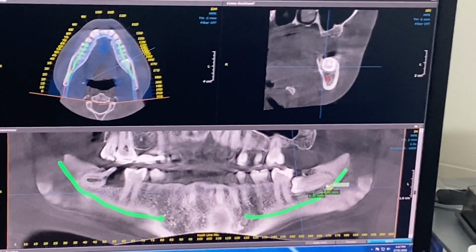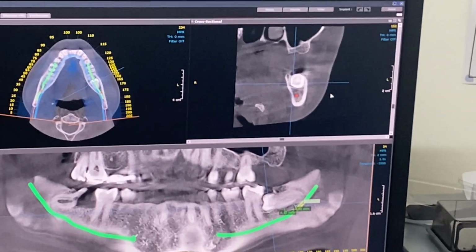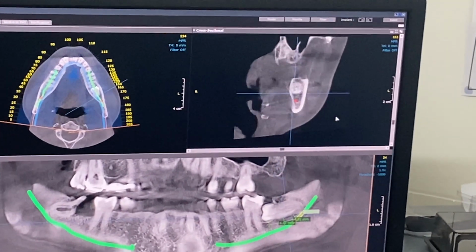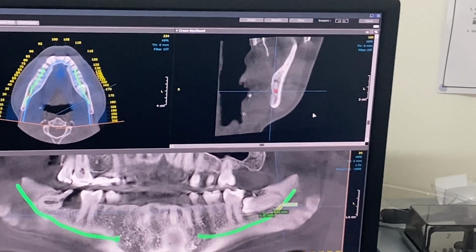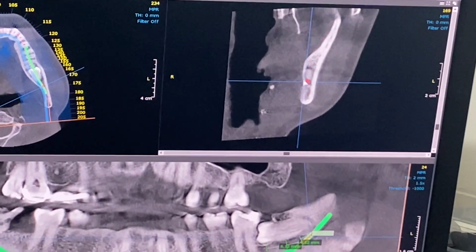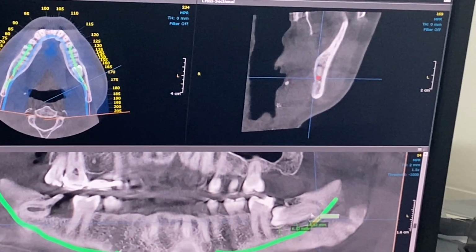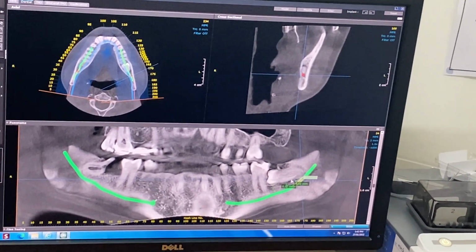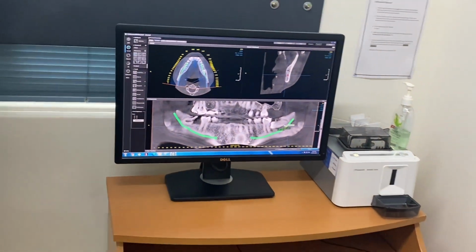And the other little interesting thing, see how the tooth sort of shortens here. If you bring the slice along to the end, in the cross-sectional view, the suspicion there's a hook on the end of that root is correlated with this image here, and it swings around at the very end and touches the top of the nerve. So hopefully by the time I get down here, this will just gently tease out and have a successful result there.